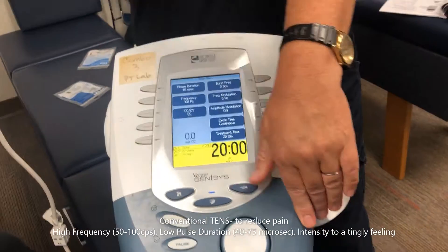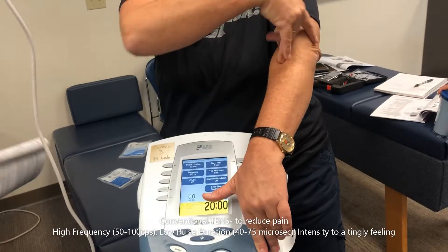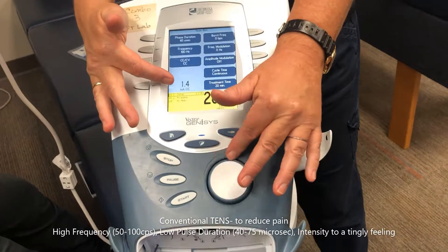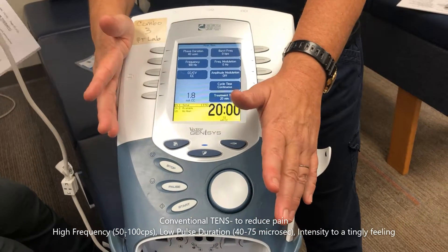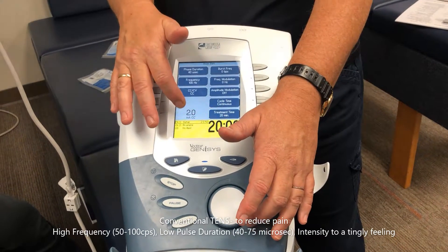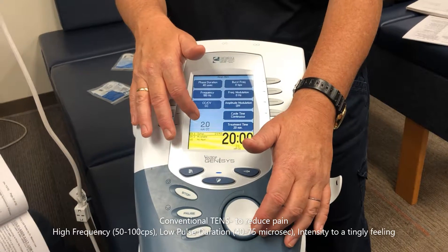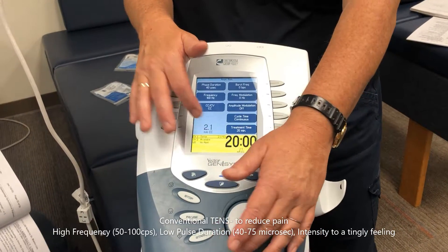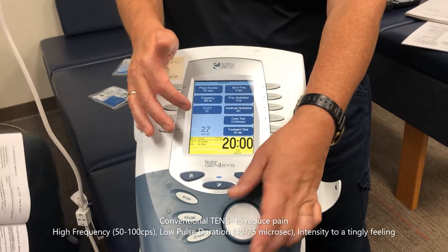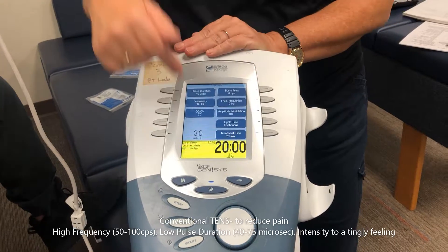We'll set up four pads with two leads. You can crisscross them — it feels better when you turn it up. Talk to the person and keep intensity at the tingling level. It's only at 2 milliamps right now; you can go anywhere from 10 to 30 milliamps.